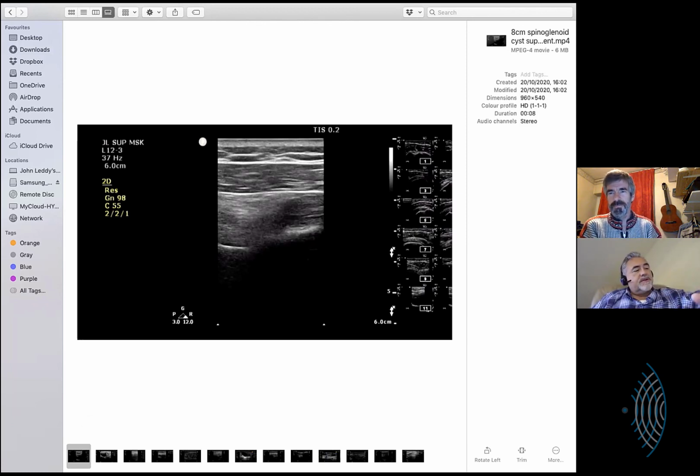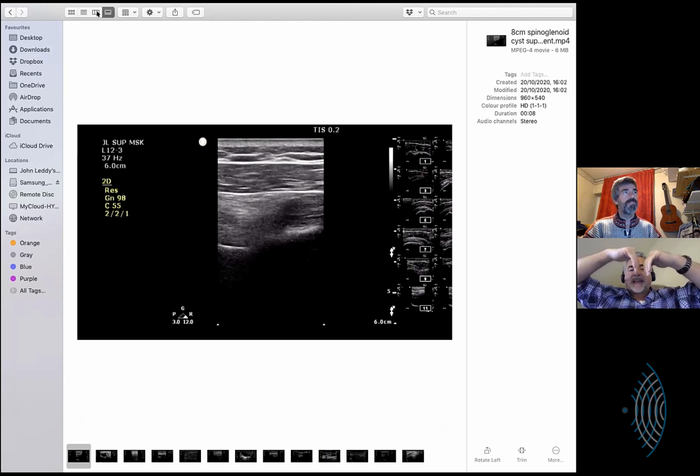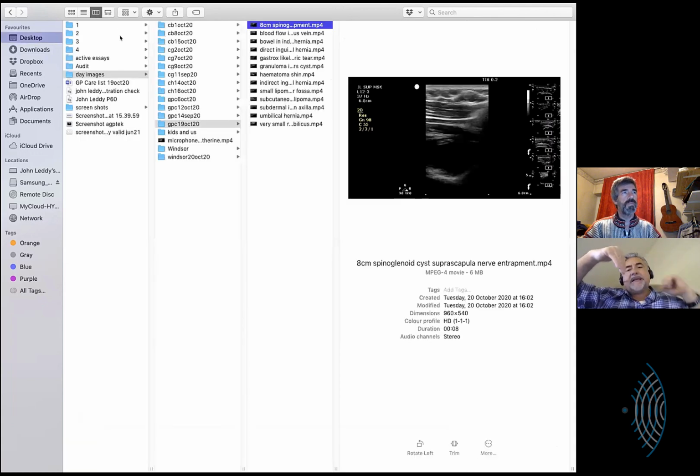Now, I want to keep going with your studies because they're far more interesting to me. But I want to ask you a question. If you ever see what looks like bony erosions, I've seen several fractured humeral heads. If you ever see that kind of crevasse proximal to the footprint of the supraspinatus, actually into the articular cartilage, the round component of the humerus, and you can find that in a scan, how confident can I be that that's worth commenting on?